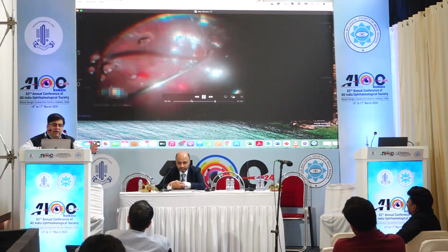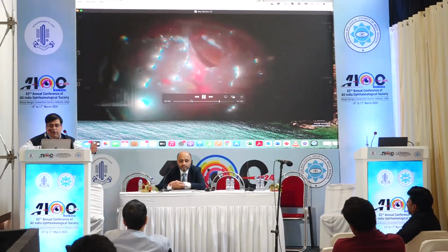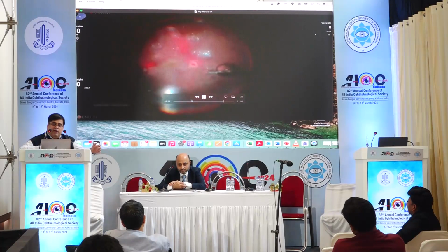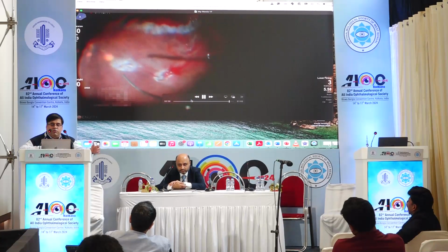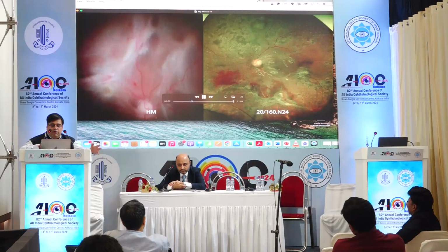I was okay to have a little larger peripheral retinotomy, almost like a retinectomy there. I relaxed that area, did a localized retinectomy, and made it a much larger single break. As Dr. Dhanashri was saying, if your membranes are pretty big ones, you can do that, and then you end up putting oil, and the patient, touchwood, did well. It was inferior, it was away, so I was able to tackle it nicely. So thank you.